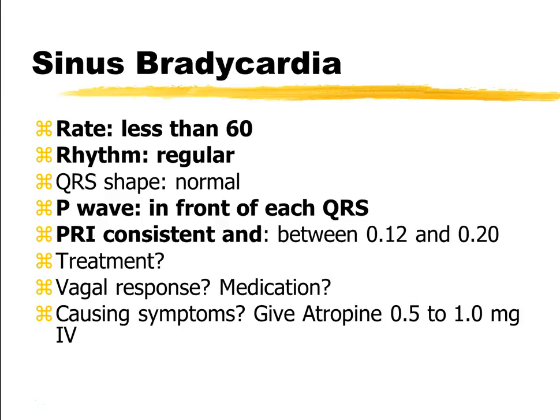All right, so now, why might someone have this? Now, they could just be like this normally. You know, you get these marathon runners, people who have healthy hearts, their cardiovascular health is great. They're just cruising around their life, less than 60. They have no symptoms. They're happy. It's fine. We don't do anything to treat them because they're fine.